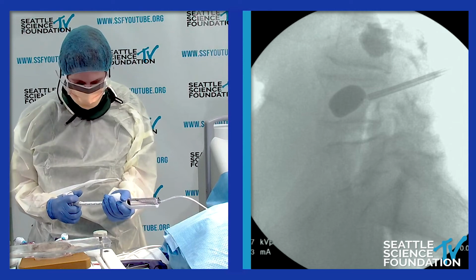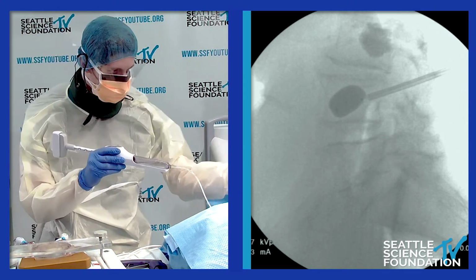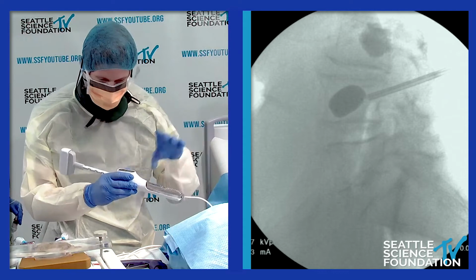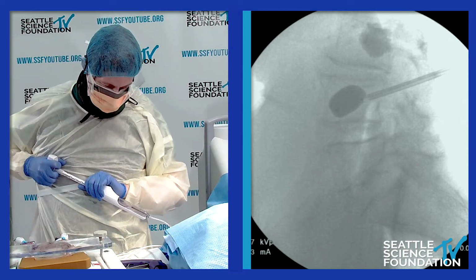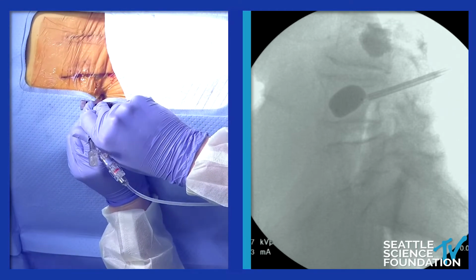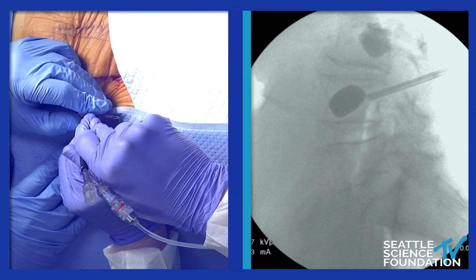But at the same time, you're creating a cavity. You're not just inserting a needle and injecting, like in vertebroplasty, which has a high extravasation rate. You're providing a cavity for using an augmenting device like a curved needle, like a lot of these companies have, to provide the cement across that very heavily collapsed vertebral body.